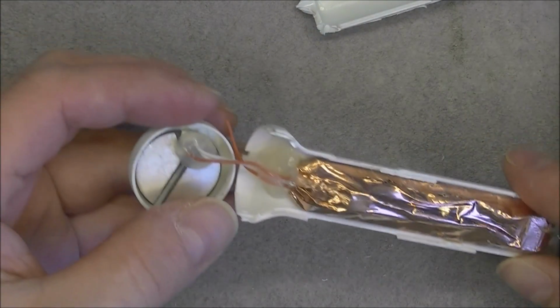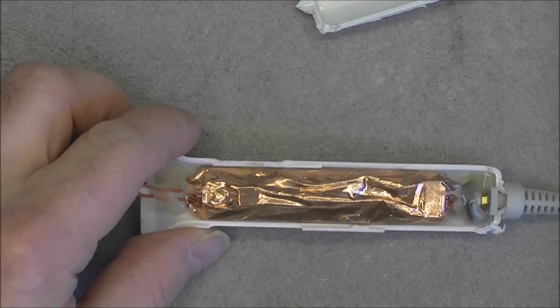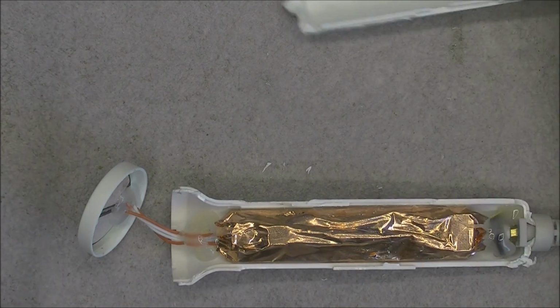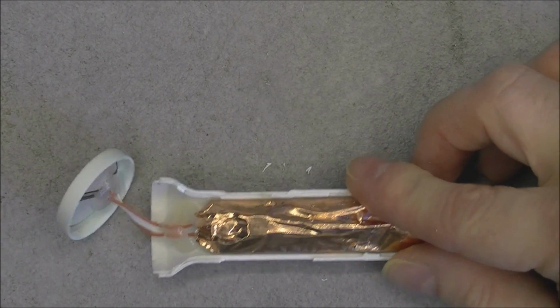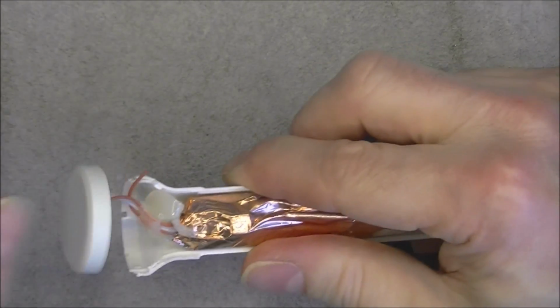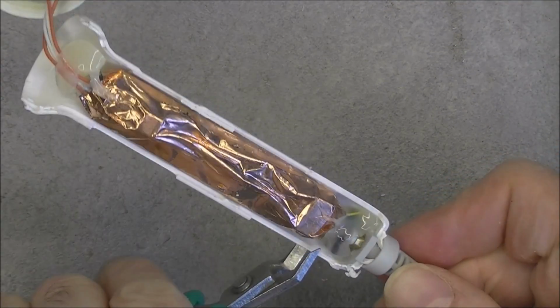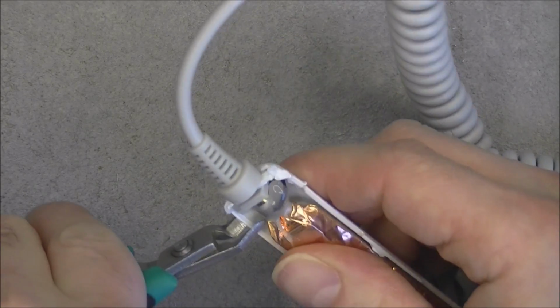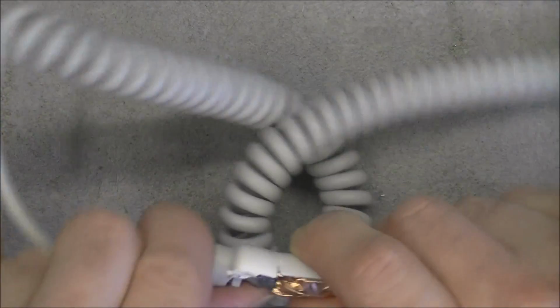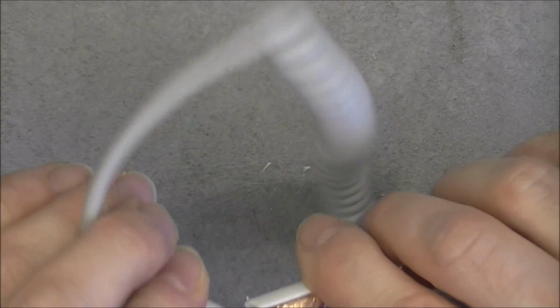Here we are, not a single drop of blood, but one loose wire here. So we obviously have a very well shielded PCB. As you can see, some glue. Always need a glue, even in the medical equipment. Strain relief here for the wire. I think the easier way to do is just to cut here the plastic. Anyway, this thing will not go together again. Oh, and we have a connector here.